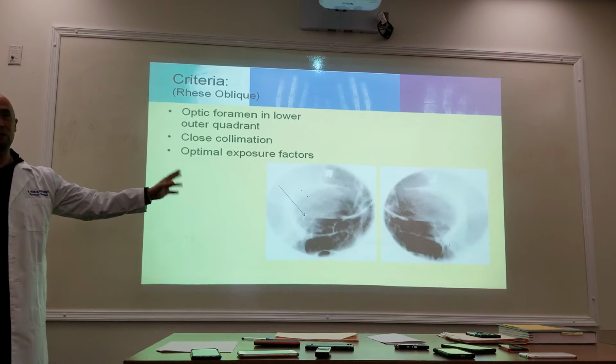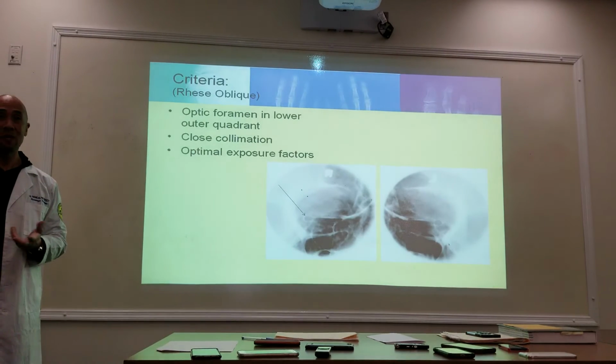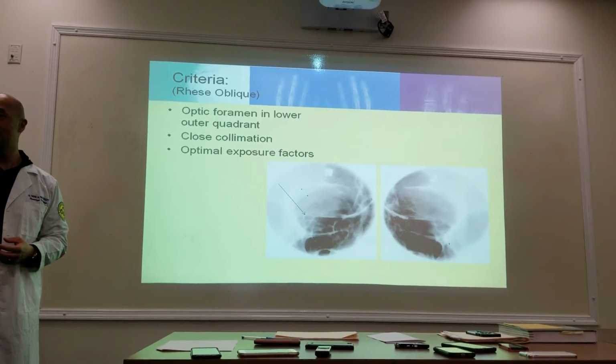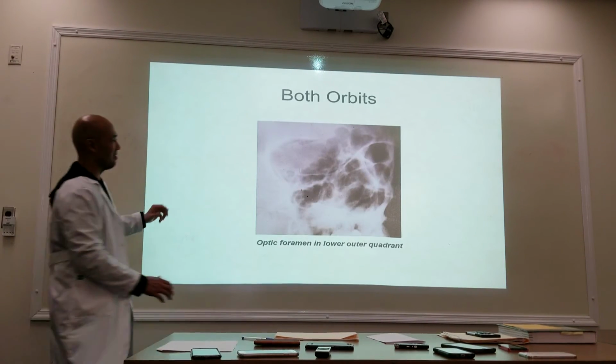Collimate to the area of interest. I don't want to see forehead. I don't want to see chin. We're going to practice collimating in class, okay? So like this. I don't need to see all this.